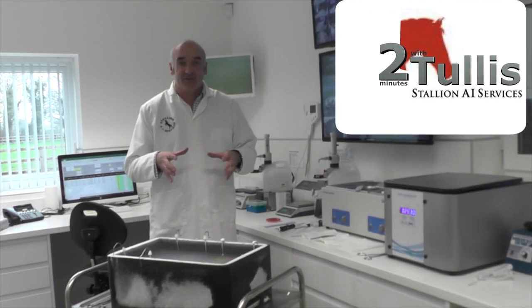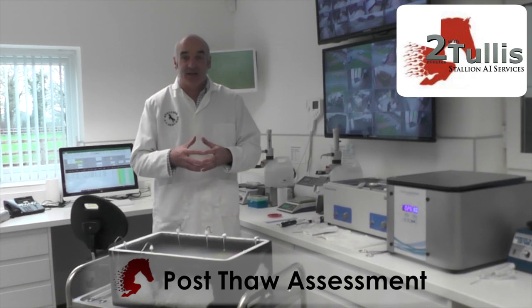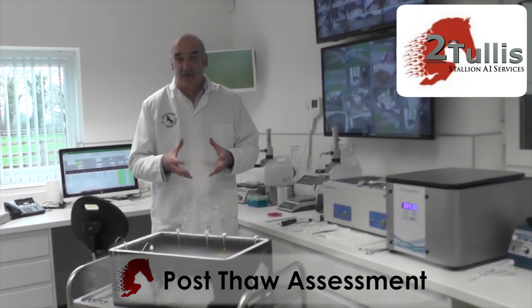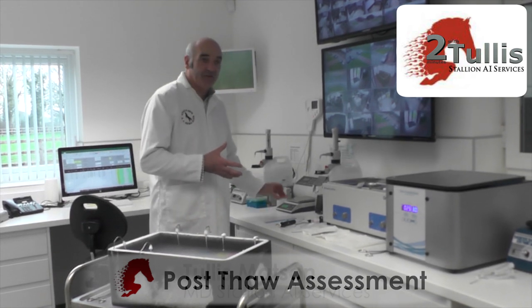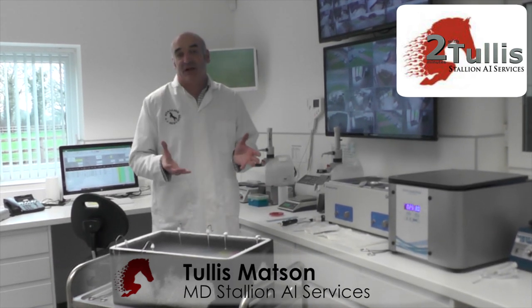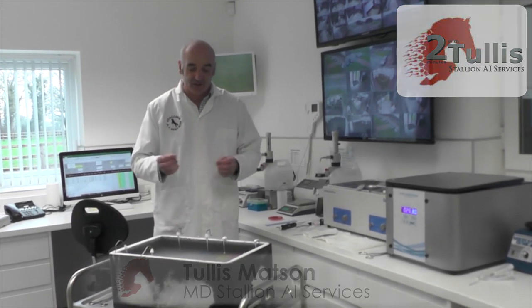Today we're going to do our post-thaw assessments of our stallions that we've collected from this morning. We do it in two stages. Today we just look at the motility, the progressive motility, the viability, and also we do a swab of the semen to see if we have any bacterial growth on it. And then at the weekend we actually look at the morphology as well with a fluorescent microscope.